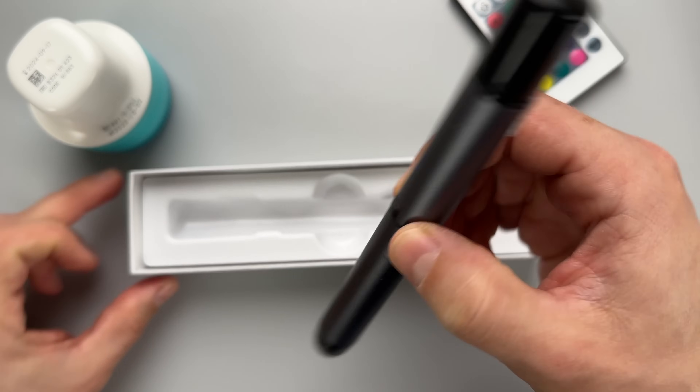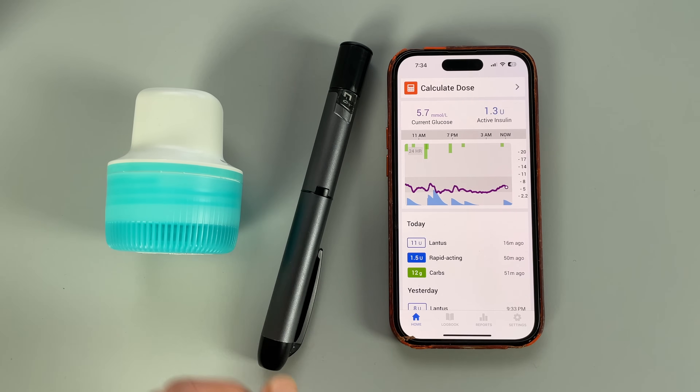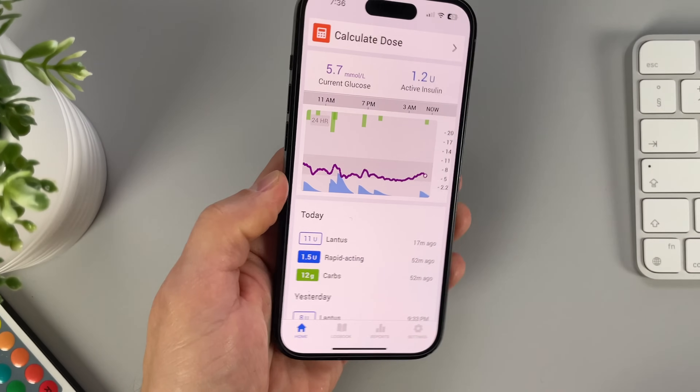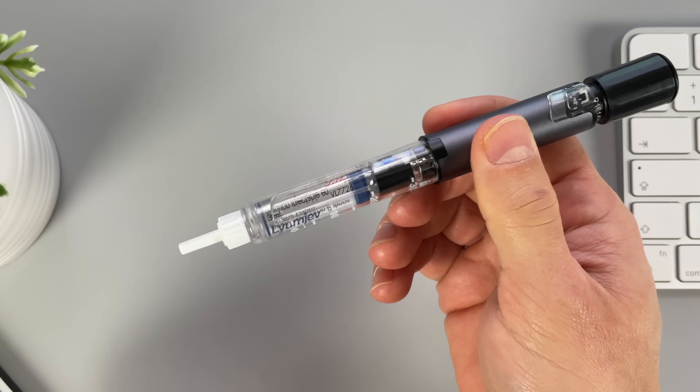A few months ago, I made a big change. I switched from my insulin pump to a smart MDI system. MDI stands for multiple daily injections, which most of you probably know. But this isn't your typical insulin pen — it combines three components: a smart insulin pen, a continuous glucose monitor, and a phone app, where all the magic happens. After testing this system for a couple months, I can honestly say that it opened my eyes to the power of smart insulin dosing and connected pens.